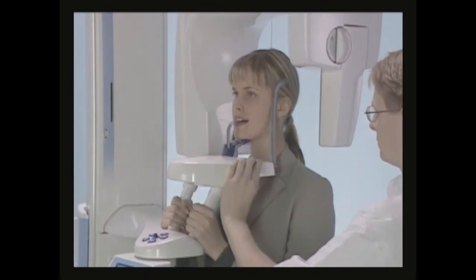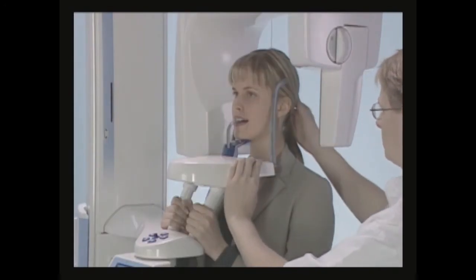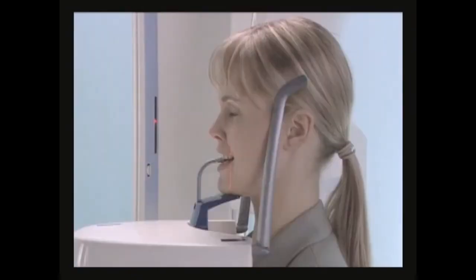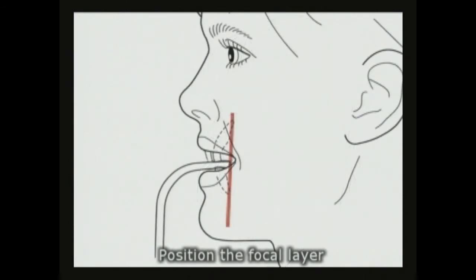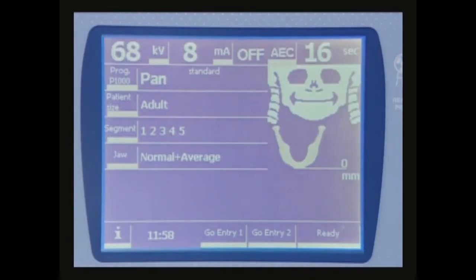The layer light indicates the center of the focal trough. Move the light with the thumb wheel to the level of the apices of the patient's central incisors. For an average patient, the light is correctly positioned when it falls between the upper second incisor and the canine. Check that the Frankfurt plane light and the mid-sagittal plane light are still correctly positioned. When you are ready to take an exposure, touch the ready field on the main display.